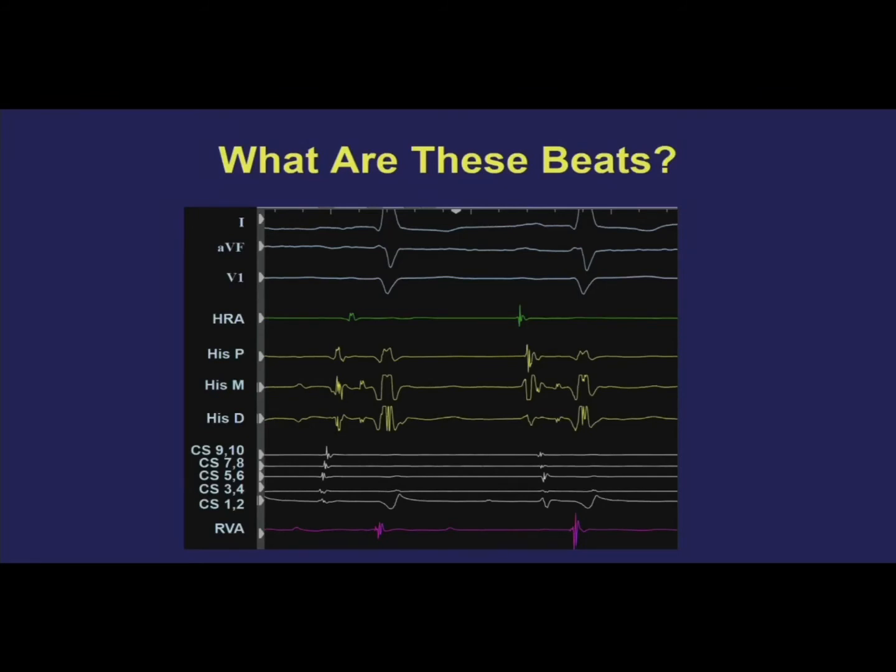So why would the HRA timing differ whether it came from the ceiling of the left atrium or the floor? It's higher over on the right side, so it's true that if Bachmann's bundle delivered signals quickly from left to right atrium, but everyone's a little different in how their atria connect.